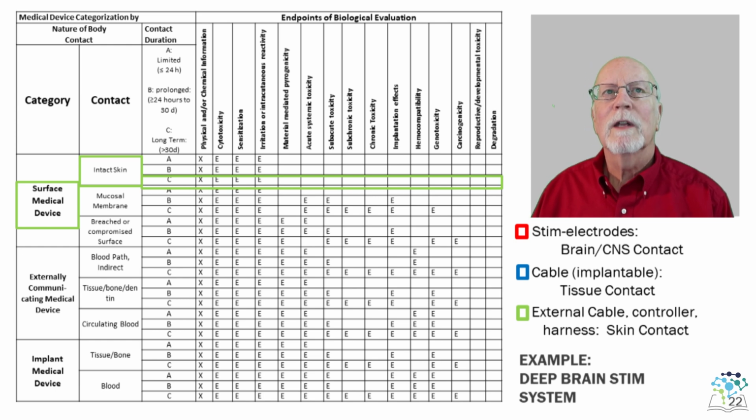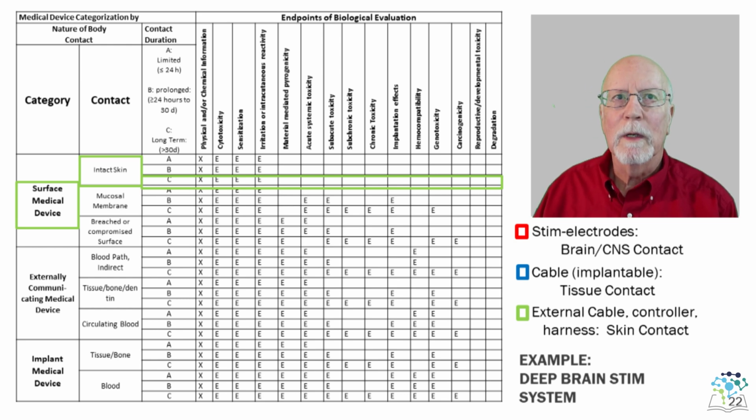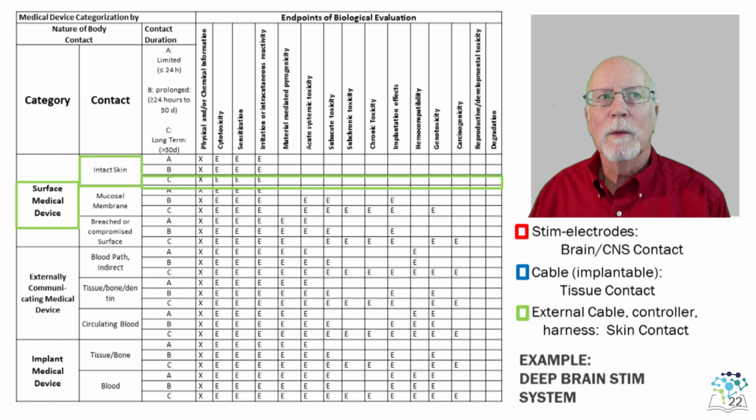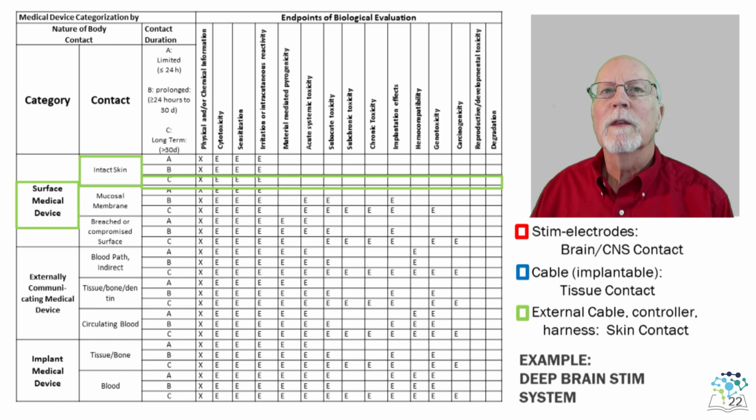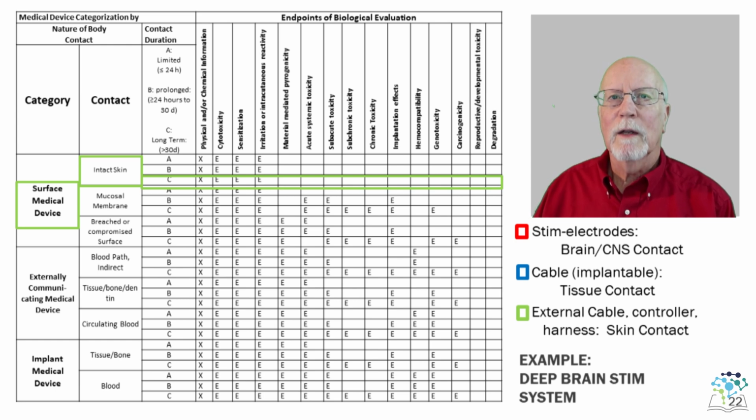Also, as this testing is not as extensive, there may be material required in this component that may not need the rigorous testing of the other two, thereby allowing for different materials or processes to be employed in the manufacturing. For example, colorants could be used if desired, or other inks or markings applied, and even with these extra materials of composition, this component of the device could be subjected to a less rigorous testing panel.